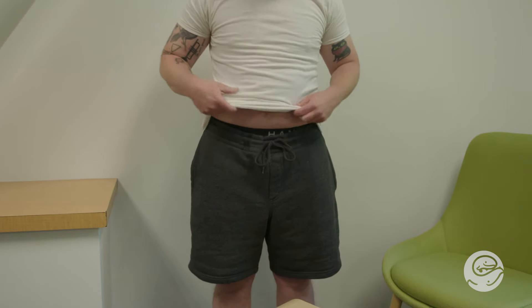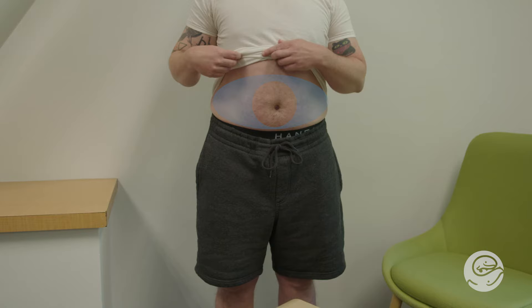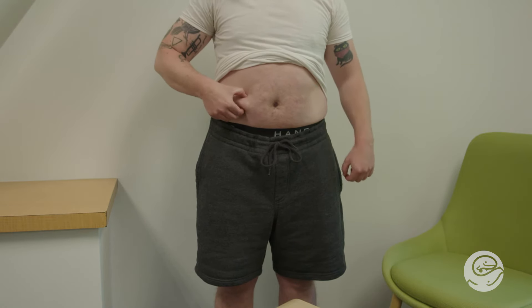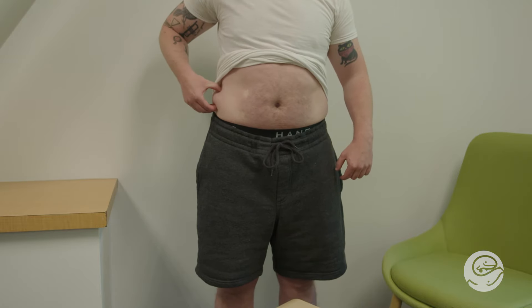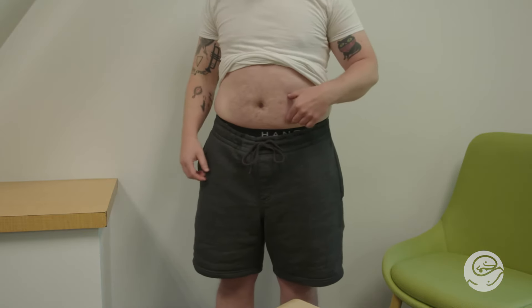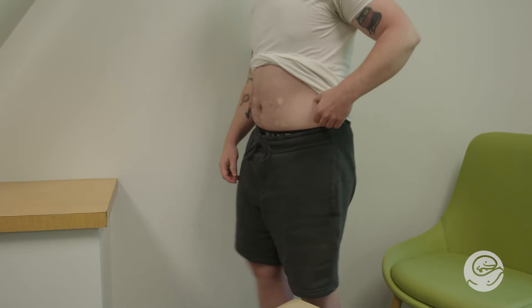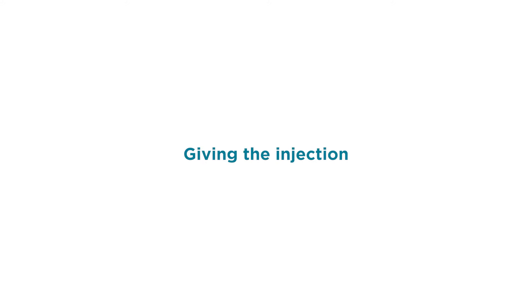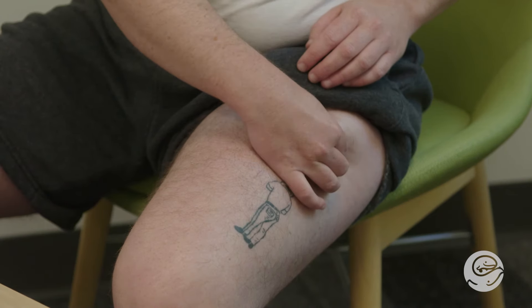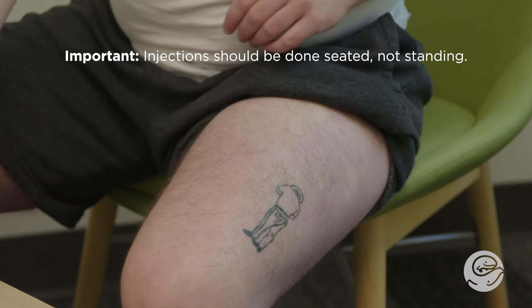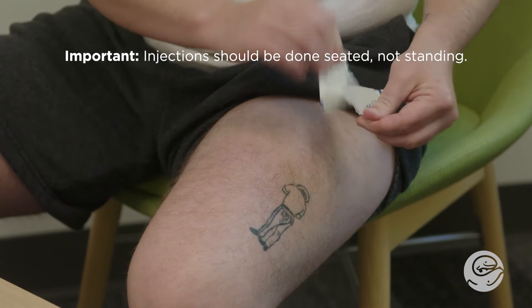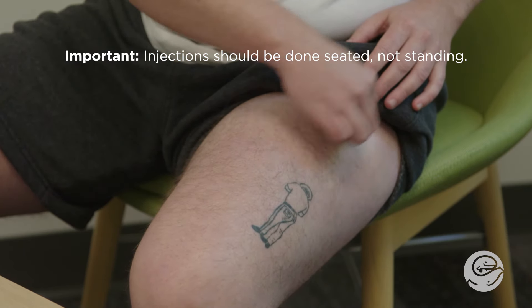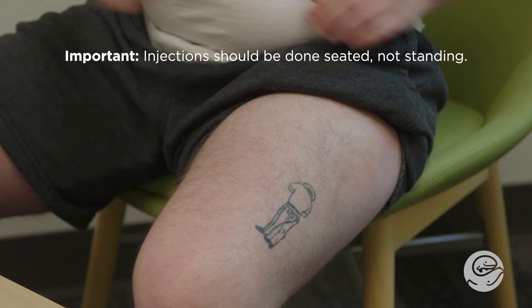If you use your stomach area, remember to stay one inch away from your belly button and avoid your waistline to prevent irritation. Use the area where you can pinch one inch of skin. Clean the injection site with a new alcohol wipe. Let it dry before injecting. Fan it gently to check that the area is dry. Do not touch or blow on the area after it is clean.